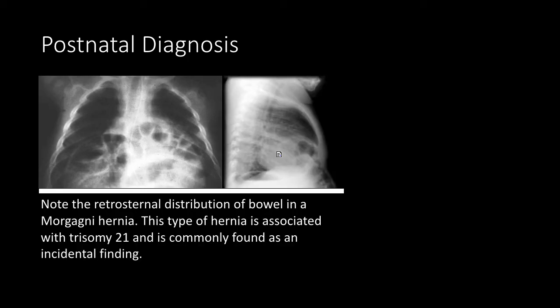The other type of hernia — the Morgagni hernia — occurs in the retrosternal area. This type of hernia is best appreciated in the lateral view, showing the retrosternal distribution of bowel. This type of hernia is also associated with trisomy 21 and is commonly found as an incidental finding.